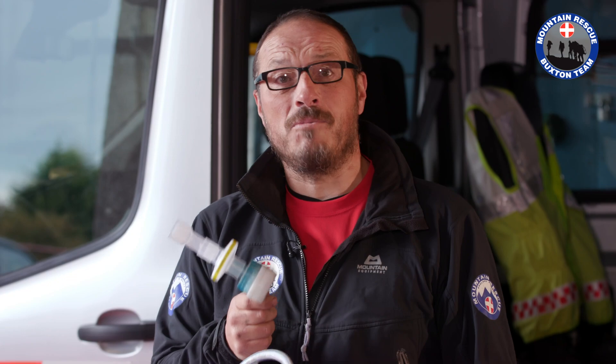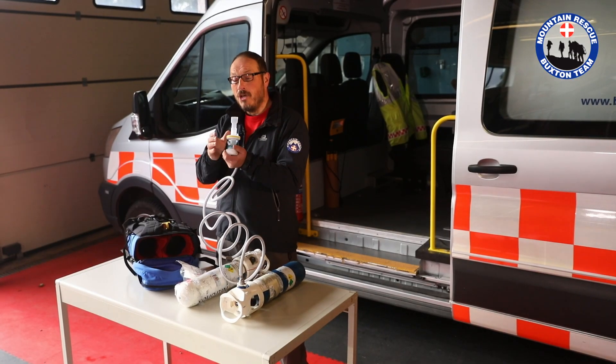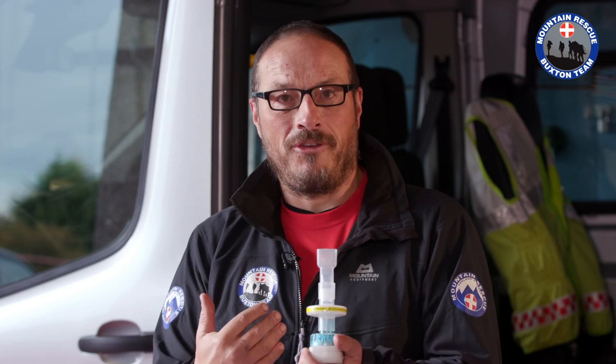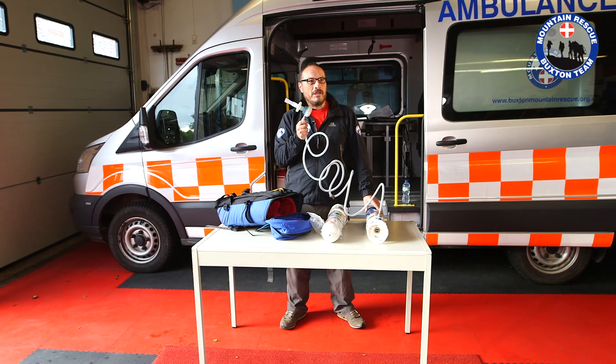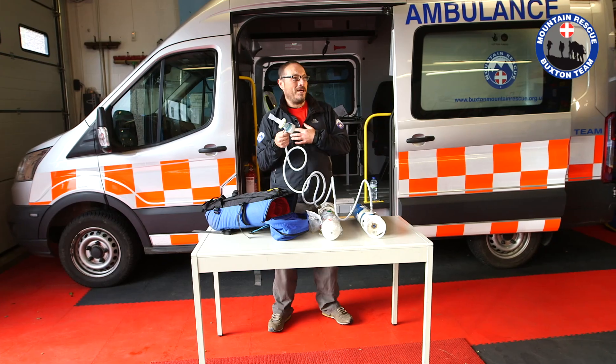The most obvious contraindication is that the casualty has to be able to administer it themselves. That means the casualty has to be conscious — sufficiently conscious to hold onto this regulator and actually take an active breath. Secondly, we have to be very careful giving Entonox if we think the casualty might have a lung injury or a chest injury. Using Entonox might bring those things on — in particular what you might call a collapsed lung, or what I might call a pneumothorax.